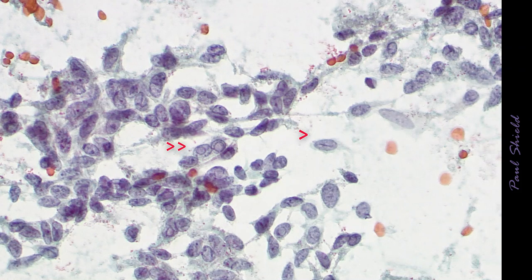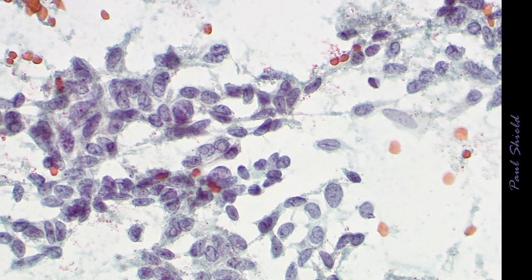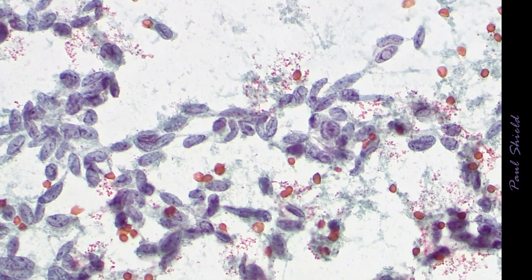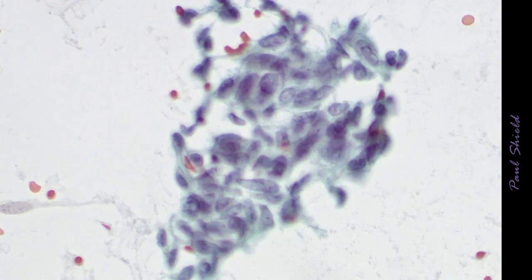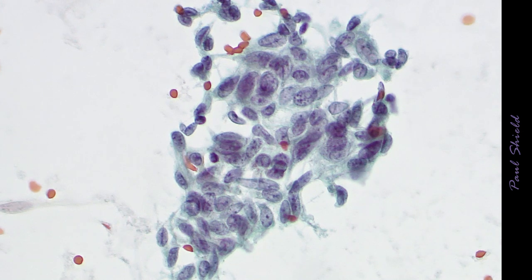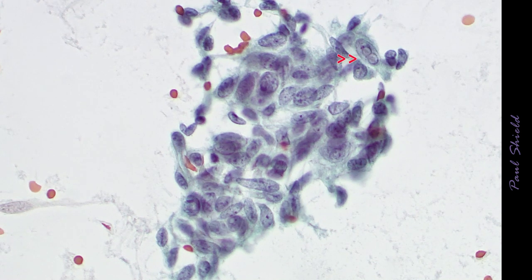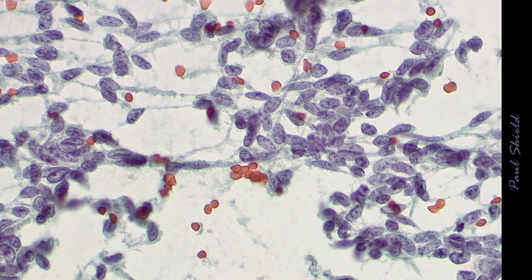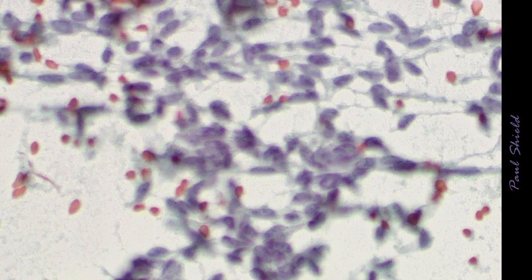Notice in this case we've got both grooves and intranuclear cytoplasmic inclusions present in some of the cells. These are seen not as commonly as in papillary carcinoma, but they can be present. Chromatin in this case is probably lightly stippled. It certainly doesn't have any prominent nucleoli, so it's really in keeping with neuroendocrine type cells.